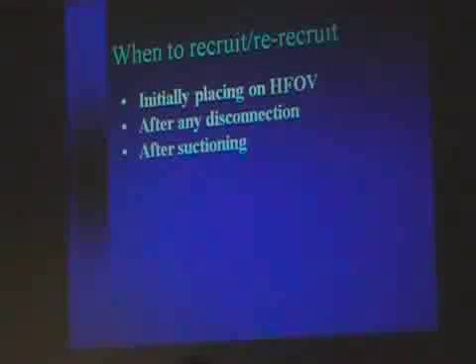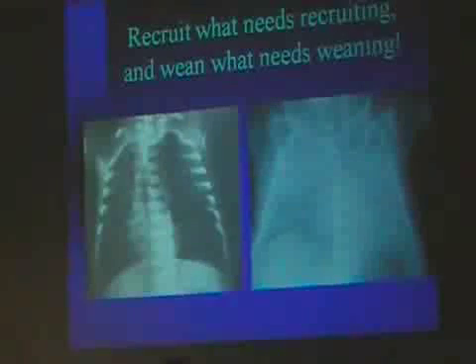The third thing is after suctioning, and David Tingay from Australia has done some beautiful work on suctioning during oscillation. It seems to be probably a little bit better to use inline suctioning. You do actually lose a little bit of lung volume. And a better way to deal with the patient after you suction him is, again, go up 1 to 2 centimeters, stay there for 5 to 10 minutes, and then go back to where you were. These are 3 areas that we, in our nursery, can be aware of in terms of optimizing our mean airway pressure on the oscillator. And I've got articles on all of this if anybody wants to see.